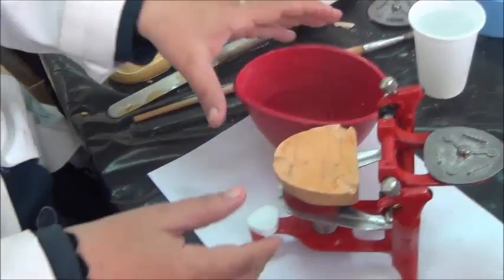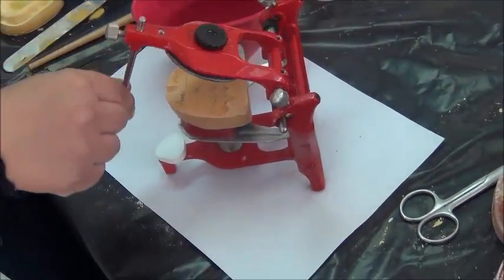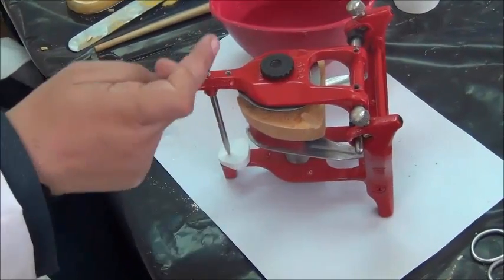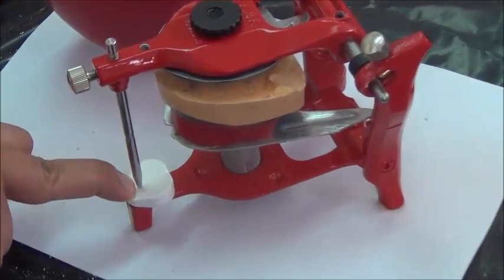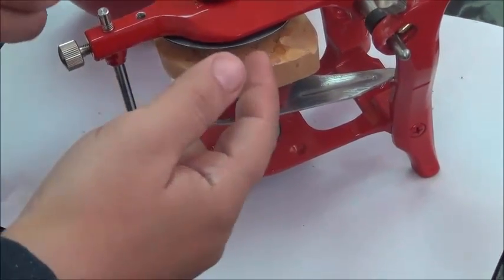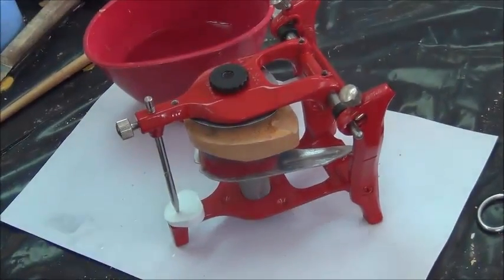Midline over the notch, centering the cast jig, closing this upper member, making sure the pin is fixed in location and it meets the incisal table of the articulator. We have clearance between the cast and the upper member, and now we're ready to do the mounting.